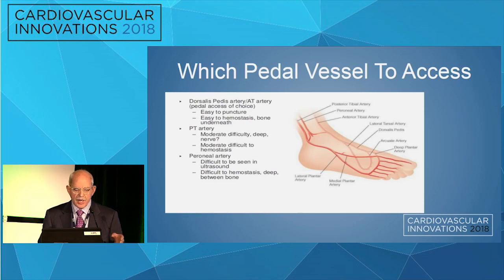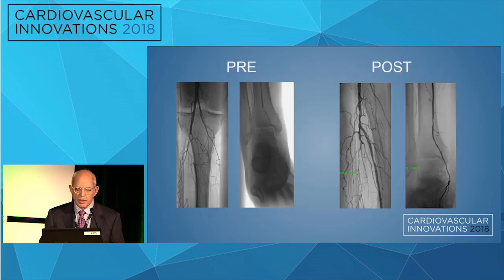Pedal access, which access, and I'm not going to belabor this, dorsalis pedis is easier, PT. The peroneal can be very difficult, and I would reserve that for more advanced, once you're more comfortable with your ultrasound and more comfortable with pedal access.